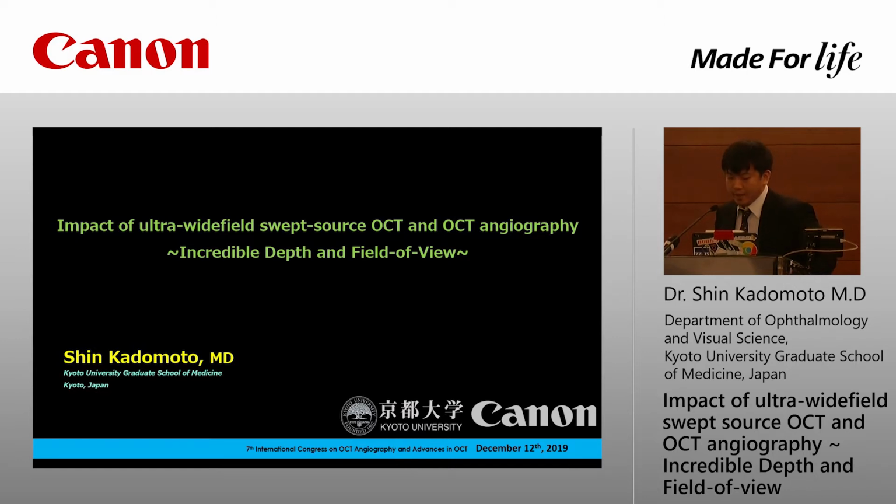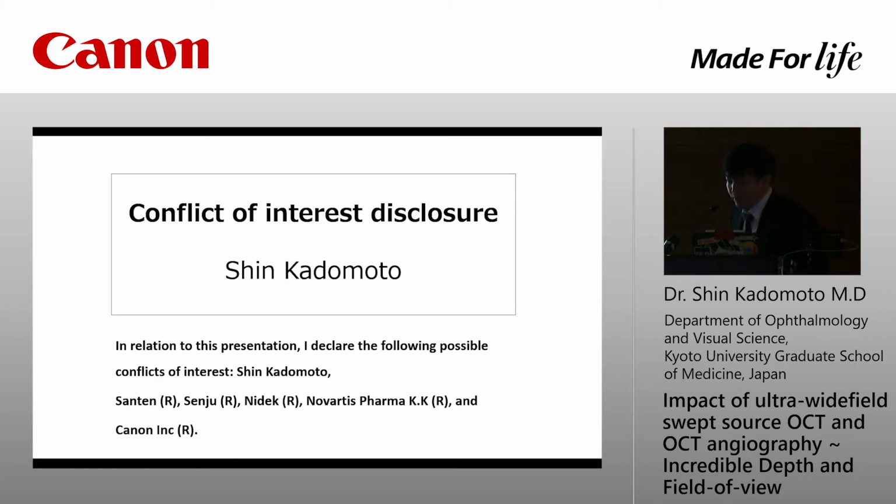So today, I would like to talk about the impact of ultra-wide field swept source OCT and OCT angiography with OCT-S1, which is produced by Canon. And these are my relevant disclosures.